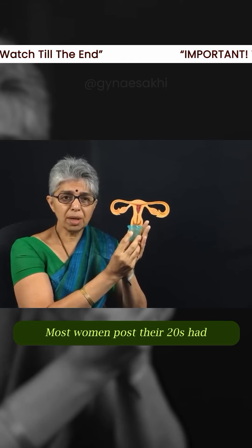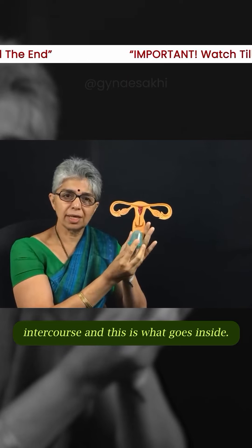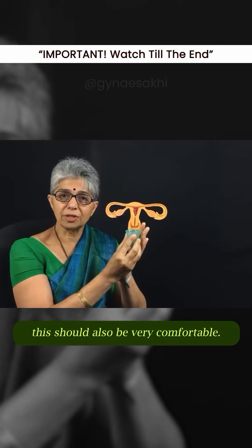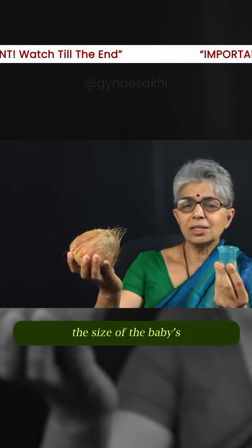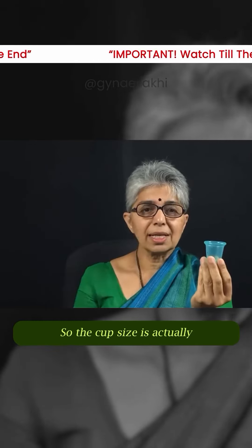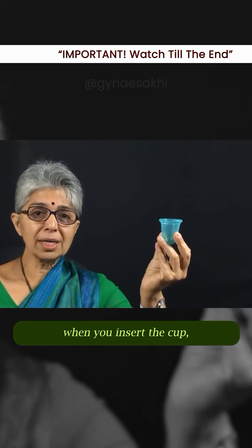Most women post their 20s have intercourse, and this is what goes inside. If that is comfortable, this should also be very comfortable. When we deliver our babies vaginally, the size of the baby's head is that of a coconut — so the cup size is actually just that of a small lemon.